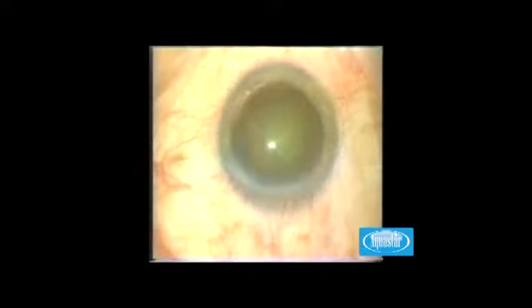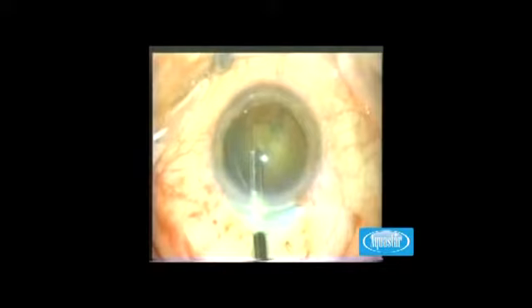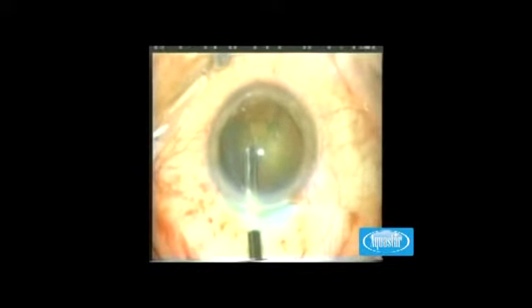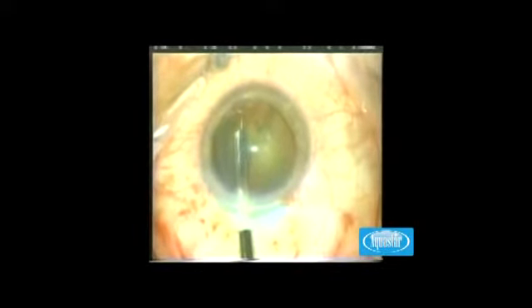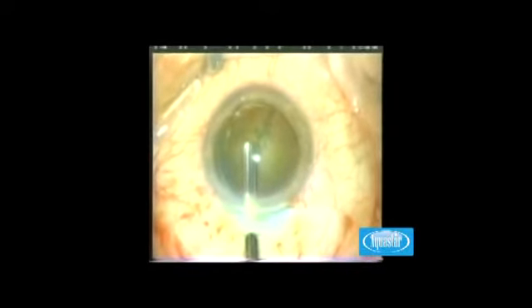The initial finding shows a traumatic mydriasis, and in another case, a congenital aniridia. An extreme mydriasis caused by trauma is compensated using IPS double elements. The anterior segment surgery is complicated due to an extensive nasal zonulolysis. For this reason, also in this instance after capsulorhexis, a capsular tension ring is injected into the capsular bag as a preparatory measure for phacoemulsification.